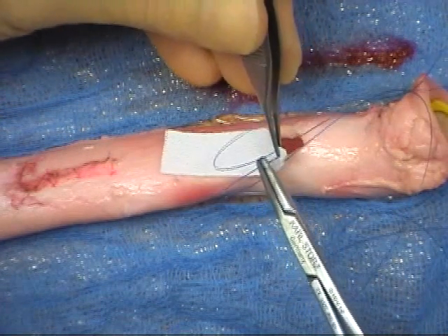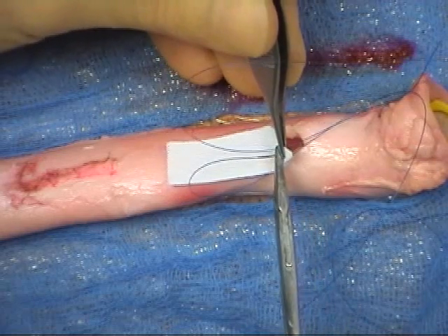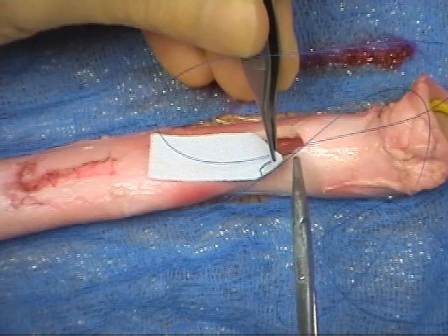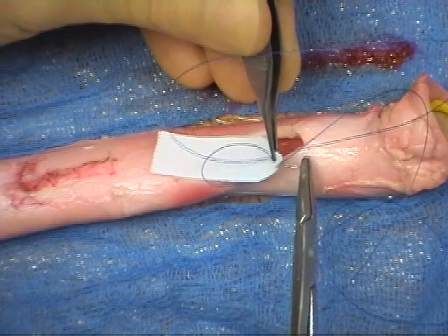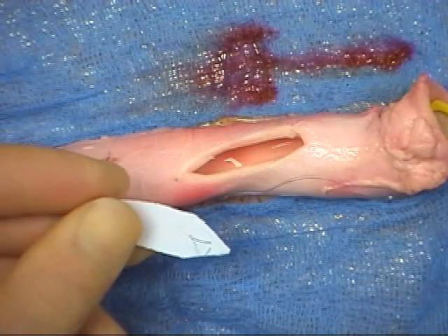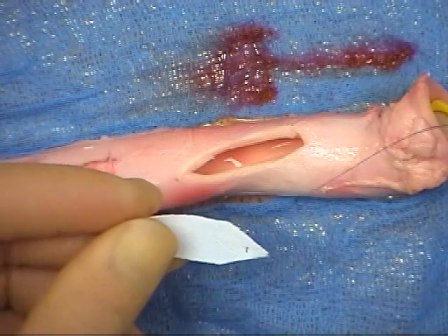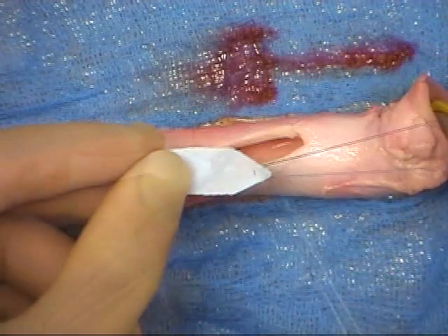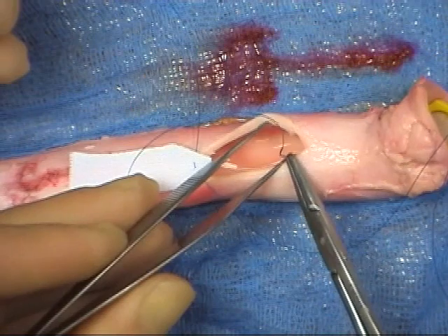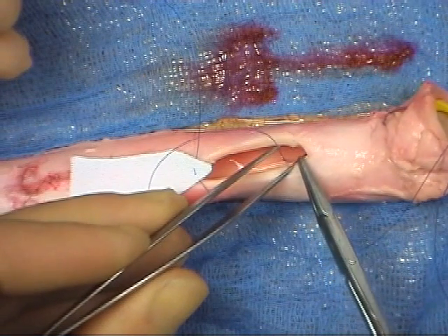The other needle is passed through the graft at a point a few millimetres away from the first bite. The first needle is then driven through the apex of the opening, from inside to out. It is important to pass sutures in this direction, to fix the intima to the graft and vessel wall, and avoid turbulent flow once the graft is in place.